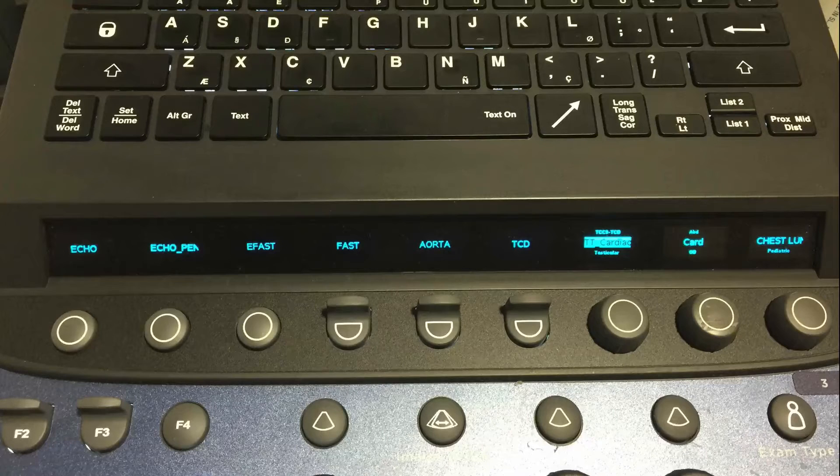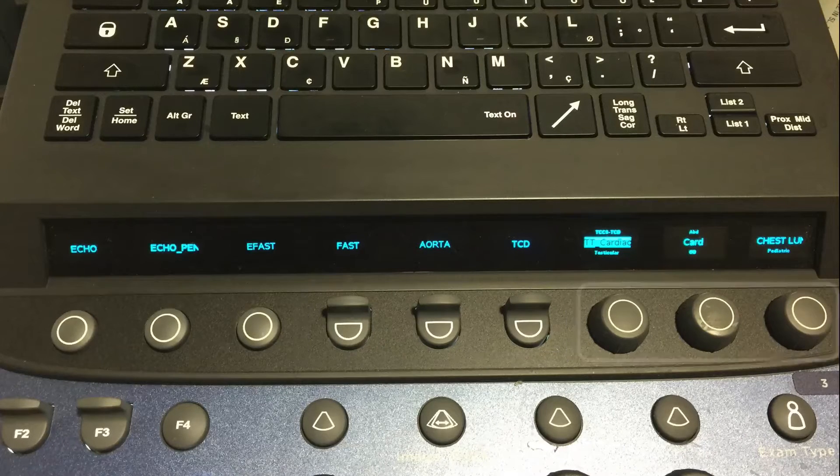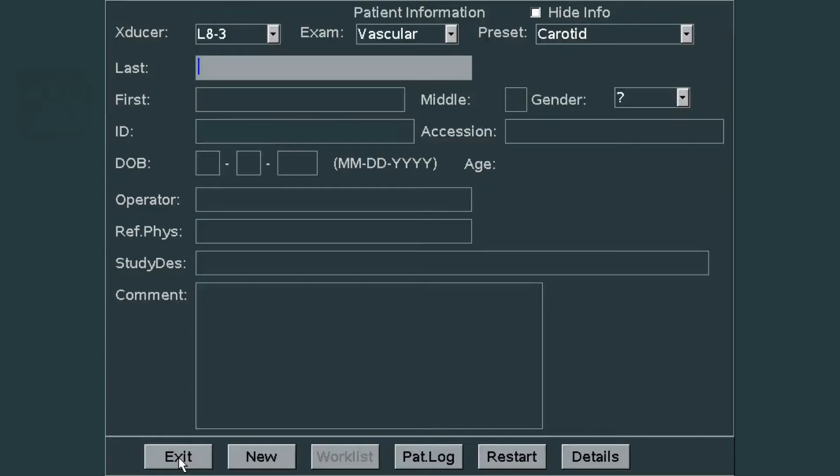These are the soft keys at the top. You'll notice some are buttons, some are toggle switches, and some are dials. We'll go over when the soft keys are used and what they are used for. When you first get to the keyboard, the first thing you're going to do is press number one or new patient to activate a new patient exam.